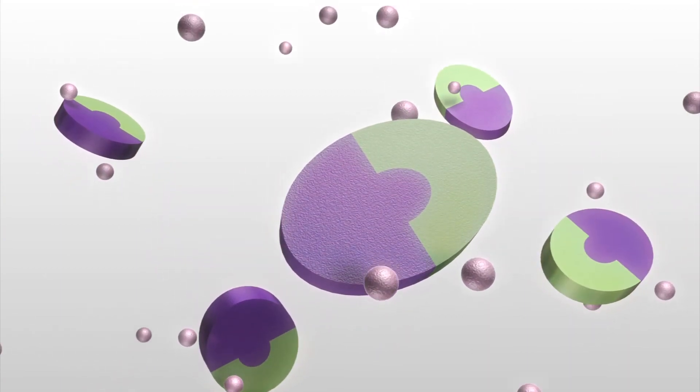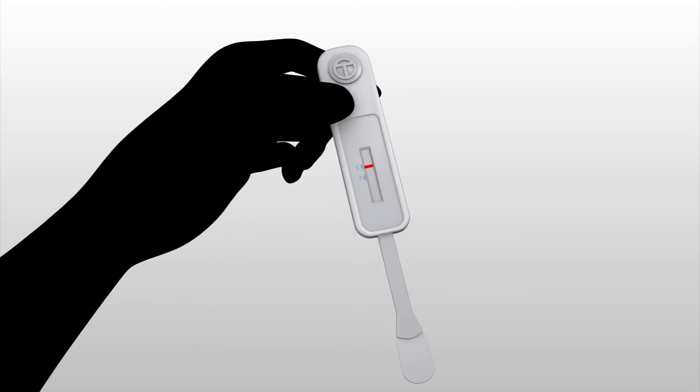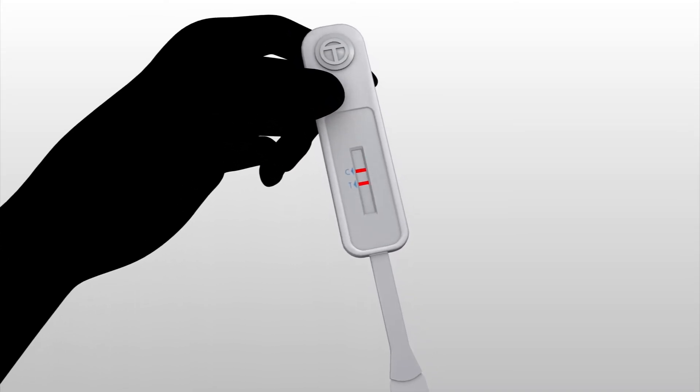The enzyme changes the color of the test paper to produce a line to indicate that the person is HIV positive.